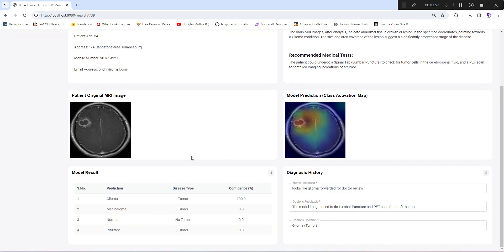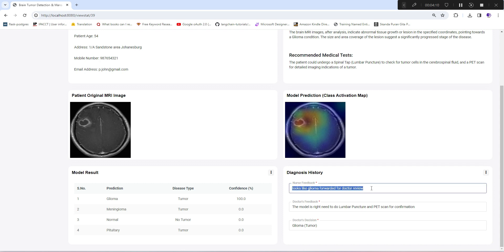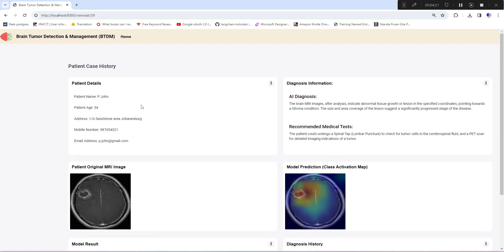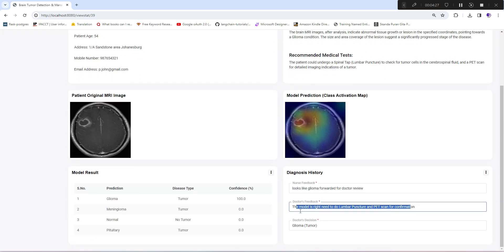Below is the model result, which shows the model's confidence, disease type, and prediction. This section is the diagnosis history where she can view what comment she gave for this case, the doctor's feedback on top of that, and the doctor's final decision.